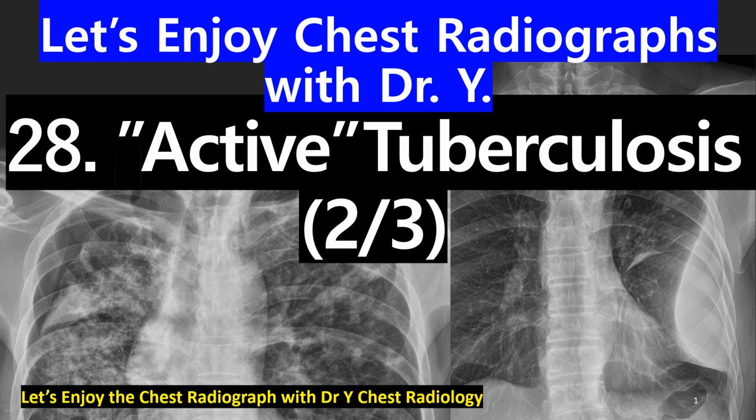Let's go into active pulmonary tuberculosis, 2 of the 3. Let's enjoy the chest radiographs with Dr. Y. I'm Dr. Y, chest radiologist, medical professor in South Korea. Today's session will be about the many findings of the real cases of active tuberculosis, the most important session of the tuberculosis. Let's go.